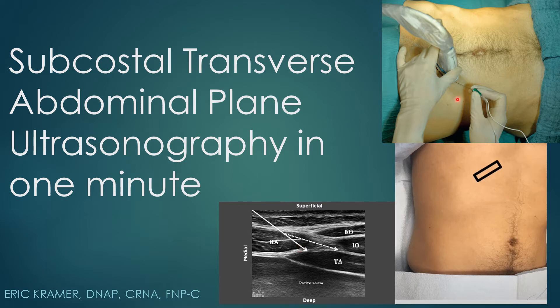If you scan more laterally, the external oblique and internal oblique will come into view, and you would also be able to deposit your local anesthetic in that traditional midaxillary spot.